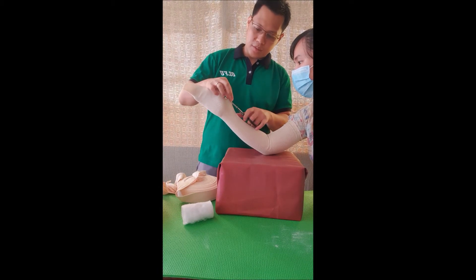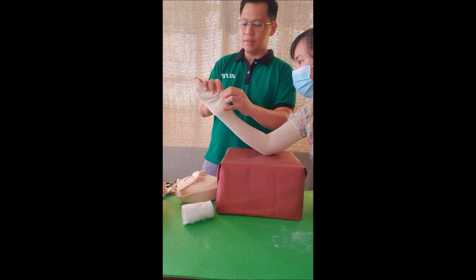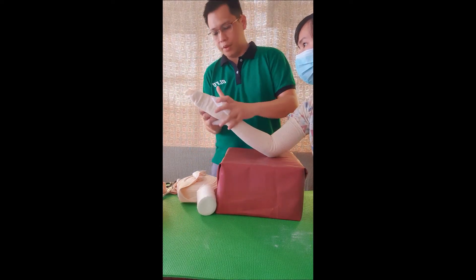We will then make a small slit along the area of the scaphoid at the wrist area. This will serve as the hole through which we can expose the thumb area. We will make a small hole for the thumb.